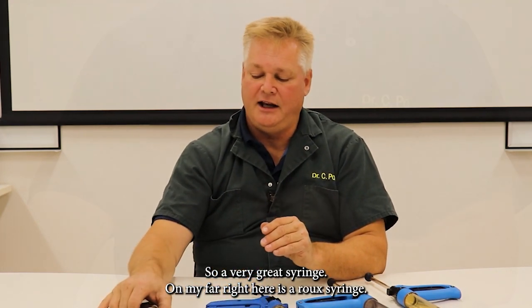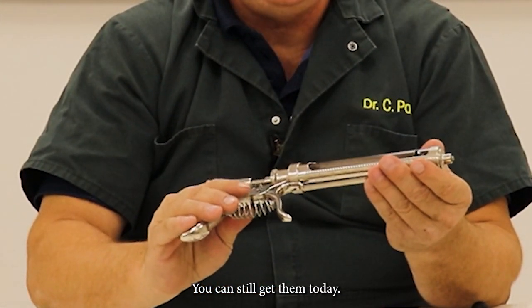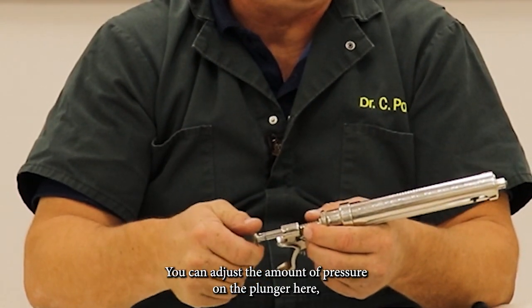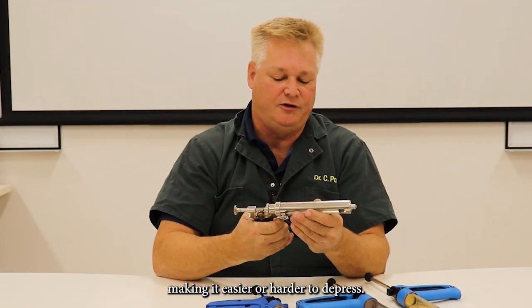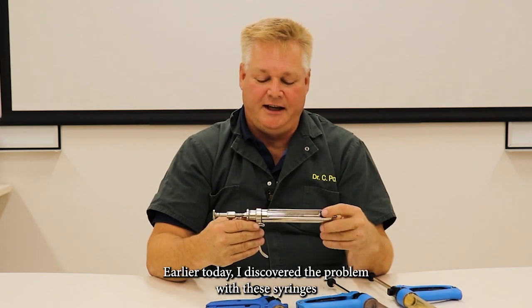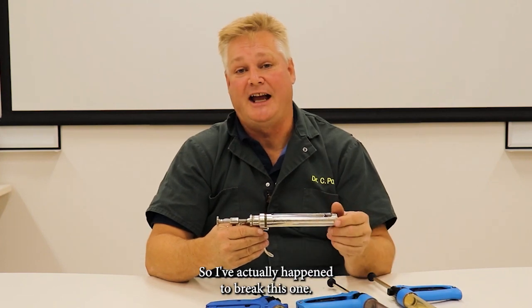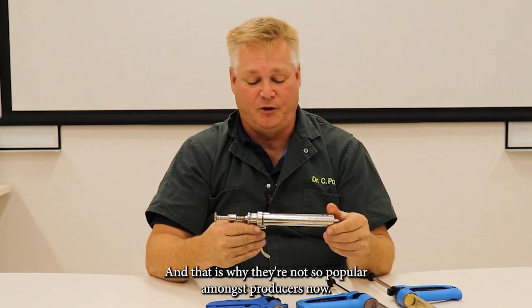On my far right here is a Roux syringe. These are the most popular type and you can still get them today. They are stainless steel and easy to take apart. You can adjust the amount of pressure on the plunger, making it easier or harder to depress. Earlier today I discovered a problem with these syringes — the glass is really breakable. I actually happened to break this one, and that is why they're not so popular amongst producers now.